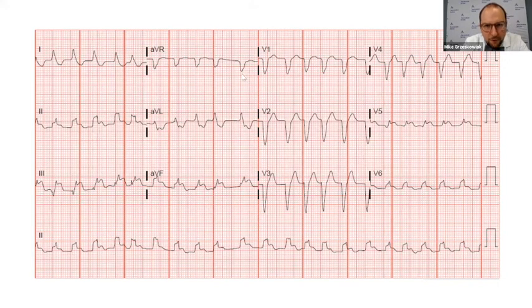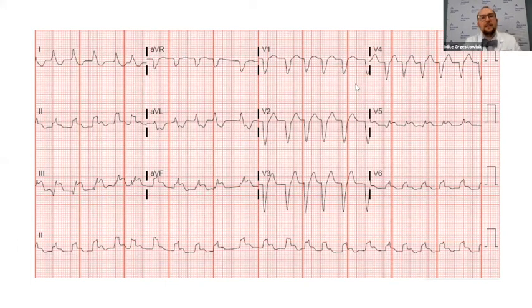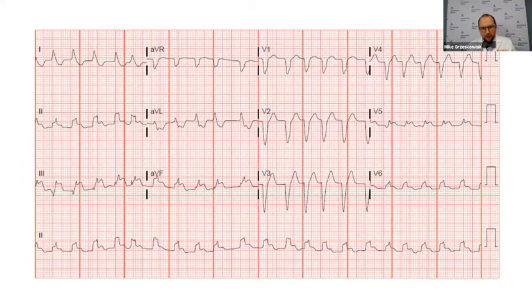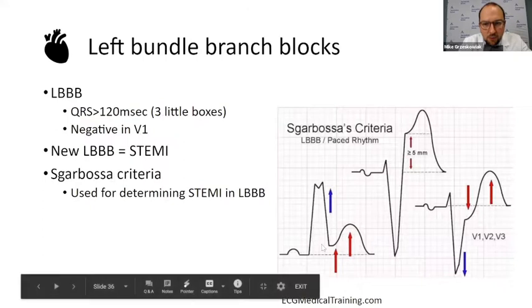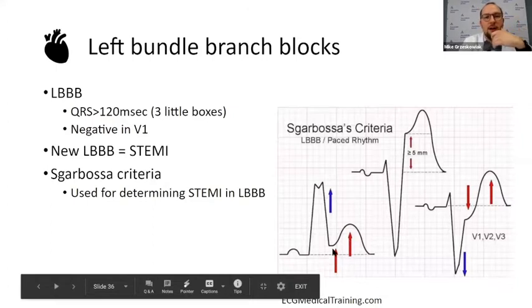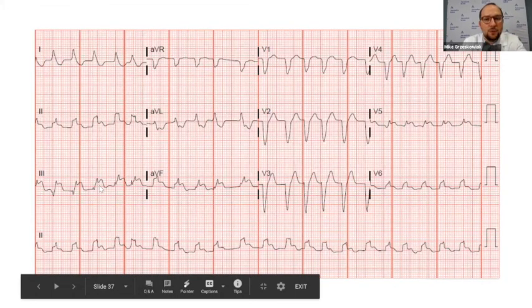Moving through the EKG, we know this is a wide QRS complex. Looking at V1 to determine left or right bundle: it's a wide QRS that's negative in V1 — negative in V1 means it's a left bundle branch block. It's negative in V1 and more than three little boxes, or greater than 120 milliseconds. Looking at the relevant lead, there are clear ST elevations definitely more than the one-millimeter Sgarbossa criterion. The QRS complex is positive, the T-wave is positive — you just need one millimeter elevation to be concerned for ischemia, and here we have four to five. This would be a STEMI.